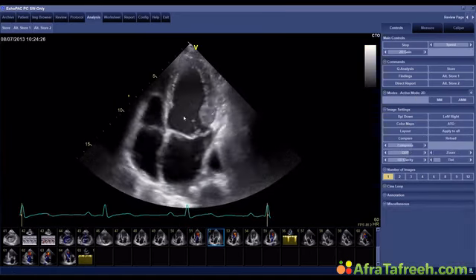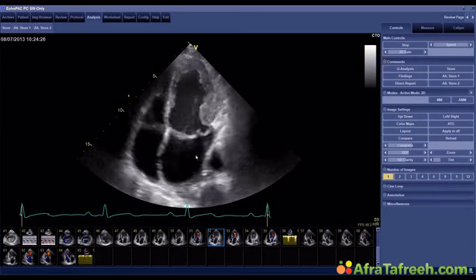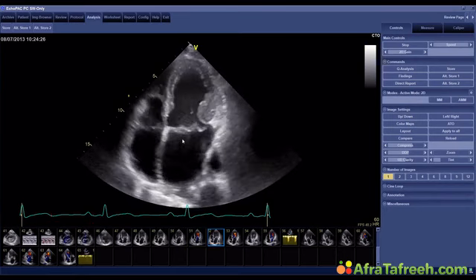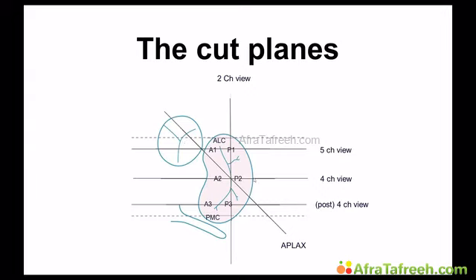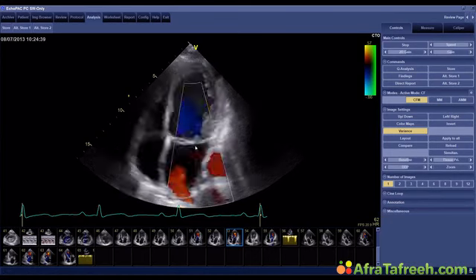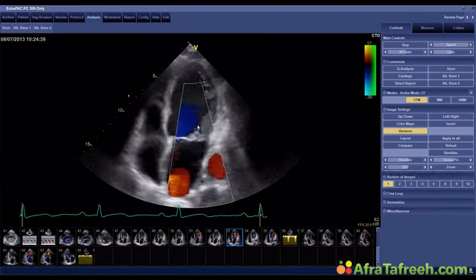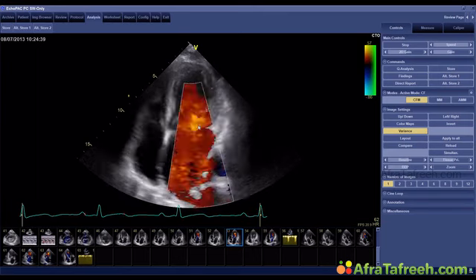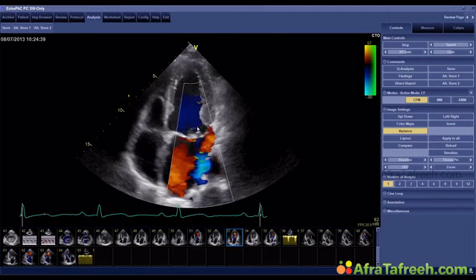Next, you move the transducer down, or slant the transducer down so that you have a typical four-chamber view. And now we're cutting right through here. Okay, this is the view you have now, and we're now crossing A2, P2. We're in the middle of the valve. What do you do? Use color Doppler. Okay, here we do have a bit of flow, more than we did before, but again, we do not really have the typical flow convergence zone that we're looking for.